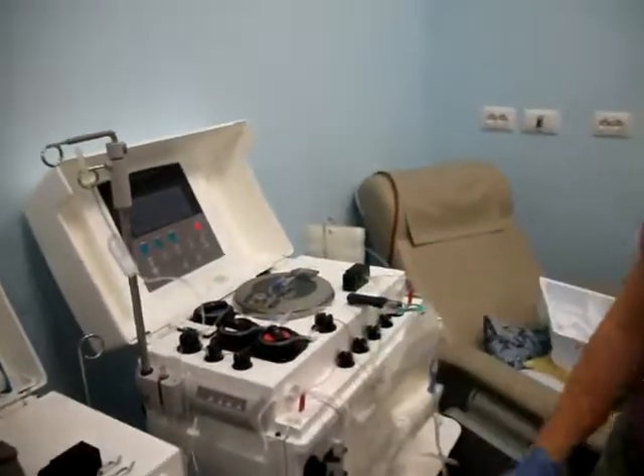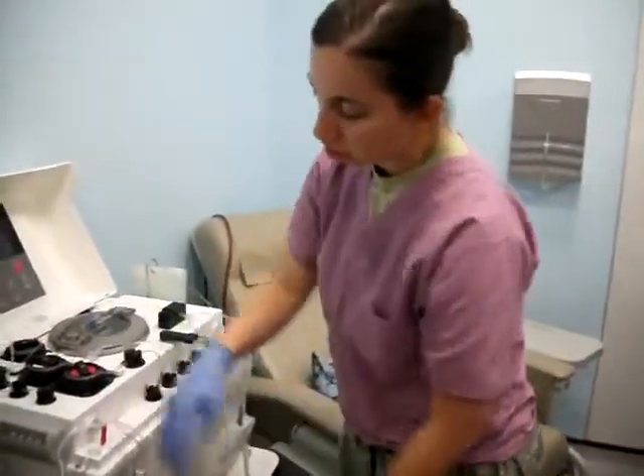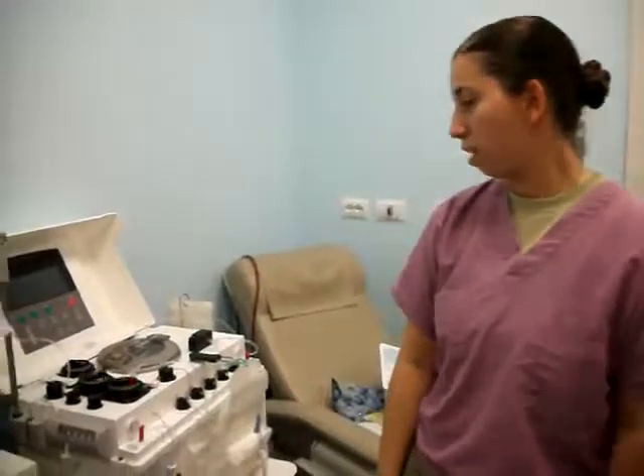Then you want to double check your work. Make sure everything's good — everything's clamped, nothing's pinched, nothing's tight. Check for kinks. And then you're good to go — hit draw, and that's it.